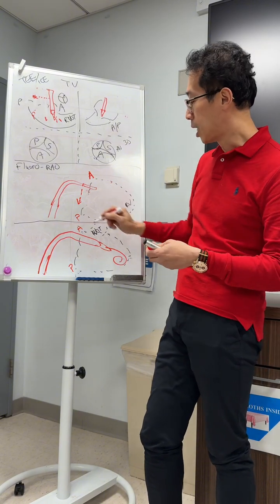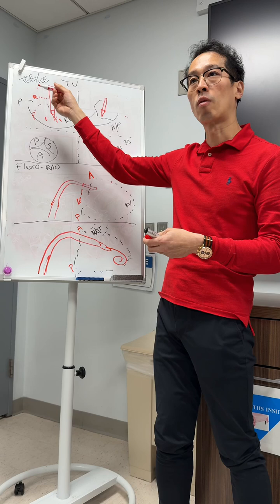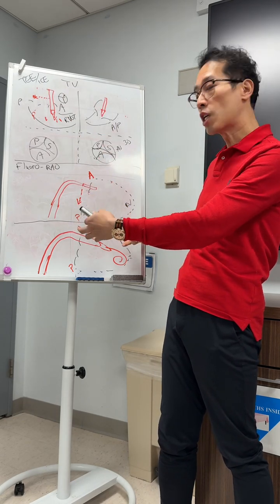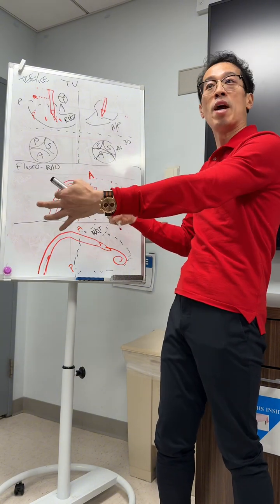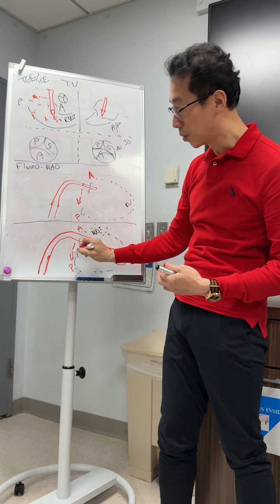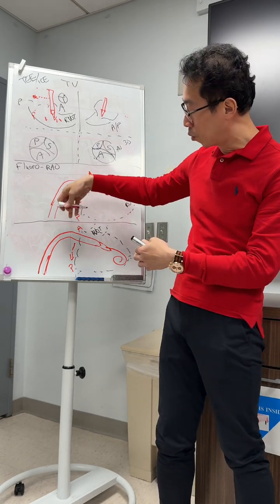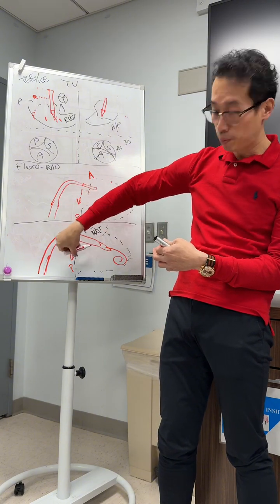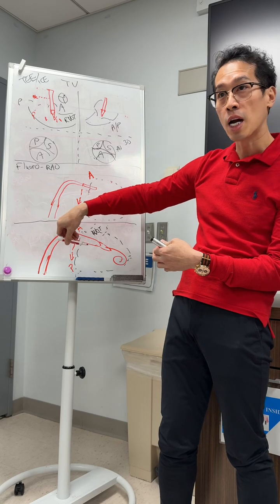Now, let's look at TTVR. So same principle. With TTVR, the stabilizer actually clicks. So you counterclock the click to bring the stabilizer. You don't have to shift it manually. And so that will allow you to go this way, and lift the wire up. But remember, you want to go this way. Make sure it goes this way and not like this. So you have to see how the wire is behaving as you come along.